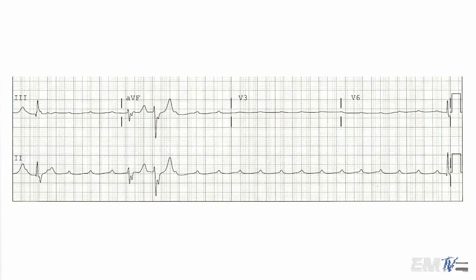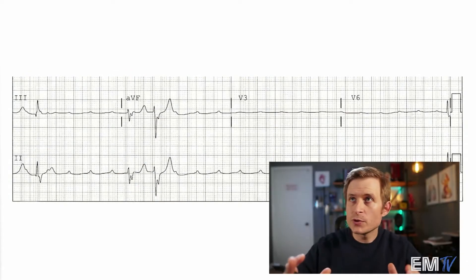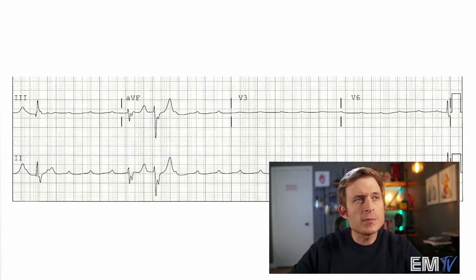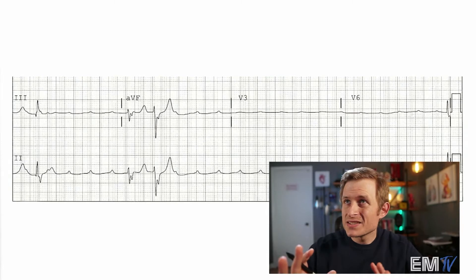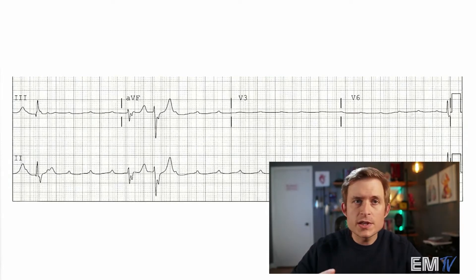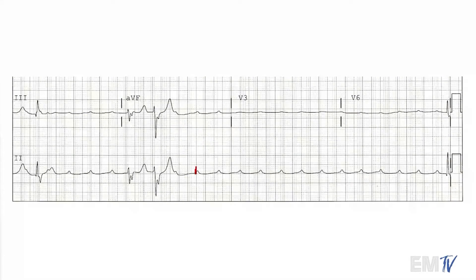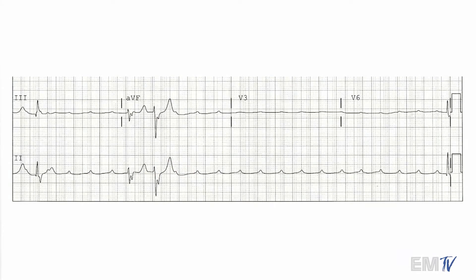Very slow. Now at first glance this rhythm may appear to be a 2nd degree type II heart block because you're seeing P waves that don't have any QRS complexes associated with them. Now this actually isn't a 2nd degree type II. If you look closely here we can follow the P2P interval and you'll see that it's actually a 3rd degree heart block. We can assume that there's a P wave buried in this QRS complex, and another buried in the one before it.